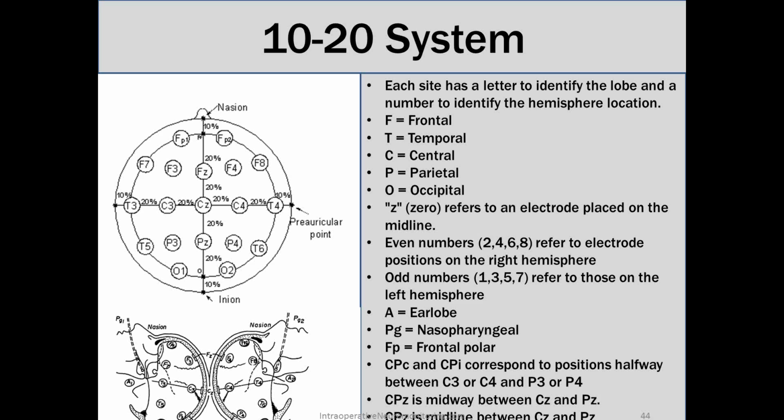All right, if we come back and look at our picture here, these might be new terms to you, the nasion and inion. They're just the locations at the very beginning of our measuring of our 10-20 system. If you've never measured this, I would recommend going on YouTube or something and watching one of those instructional videos on how they go around measuring it.